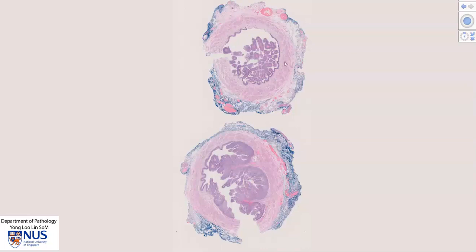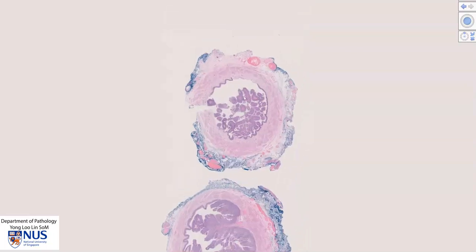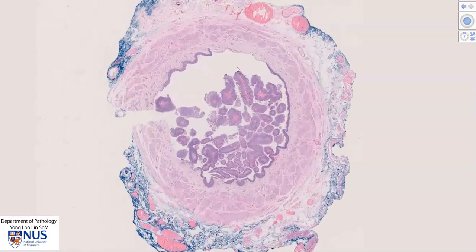So here is the wall, and this little lining here is the urothelial lining, and we have a tumor that has a papillary or finger-like or frond-like configuration projecting into the lumen. This can often cause obstruction of the ureter and therefore proximal ureteric dilatation and even hydronephrosis.